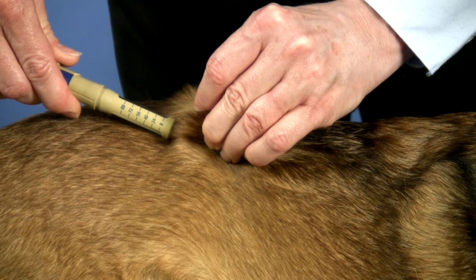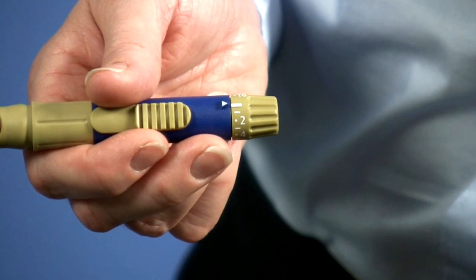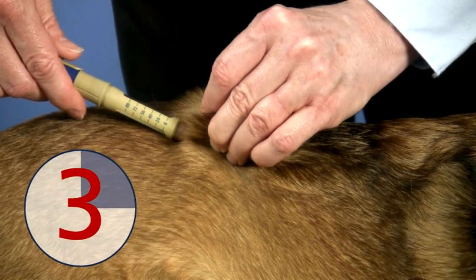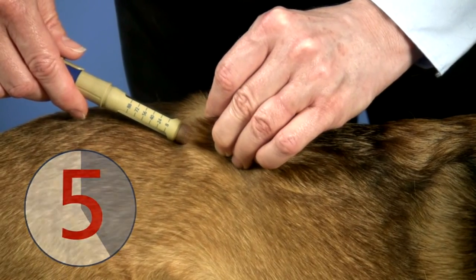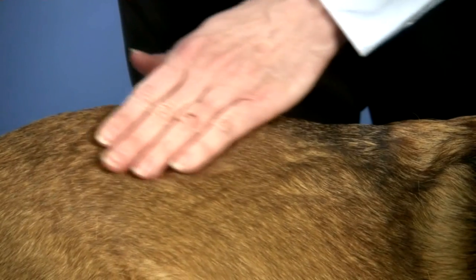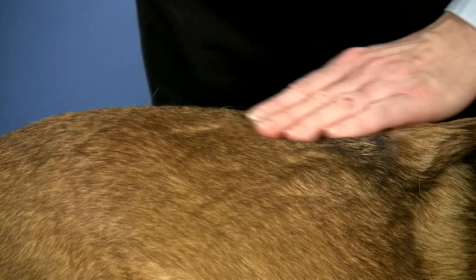Then push the release button towards the pen needle and hold it in place until the starting line on the dose selector returns to the arrow on the VetPen body. Hold the needle in place for a minimum of 5 seconds, counting slowly to 5 to ensure the entire insulin dose has been delivered. Then remove the needle from the skin.